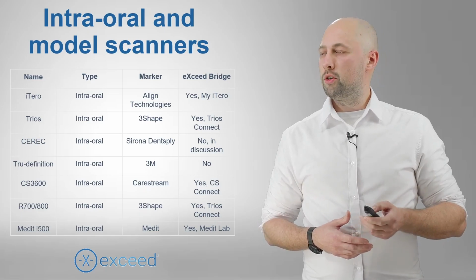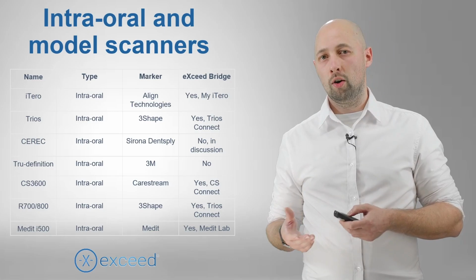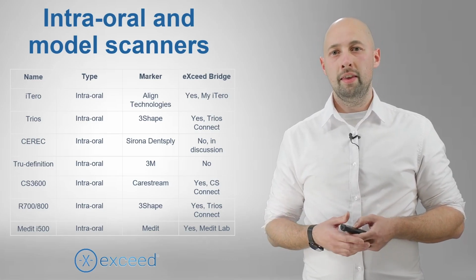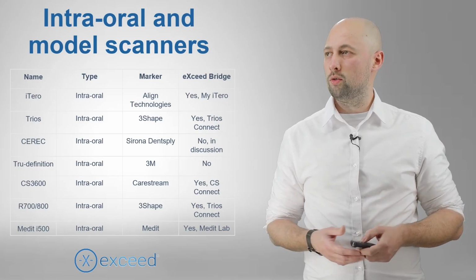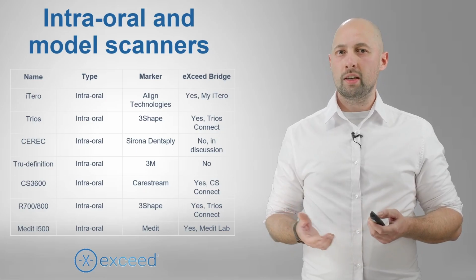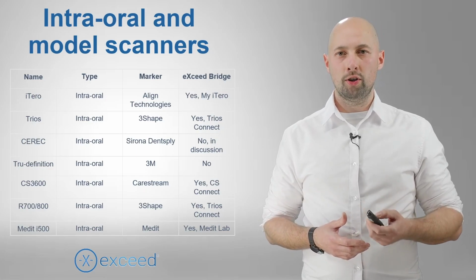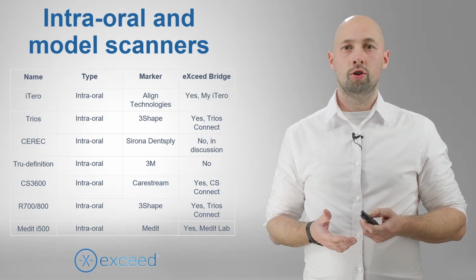If some of your customers do not have access to intraoral scanners, they can use silicone dental impressions instead. In this case, you will need a place to create the stone models, or the gips models, plaster models, and then access to the desktop scanners to digitize the impressions, the models, to create accurate digital records.